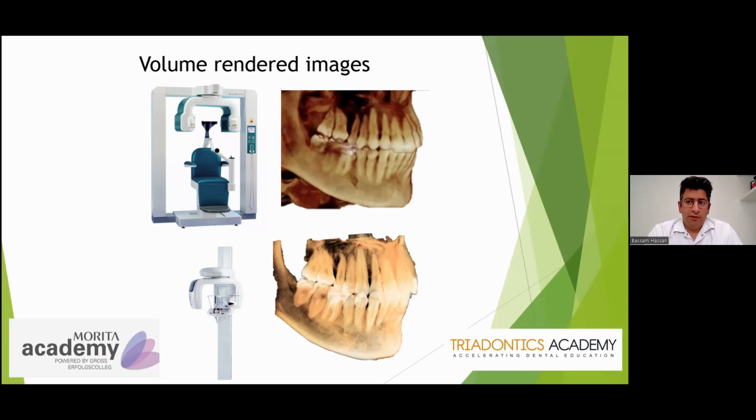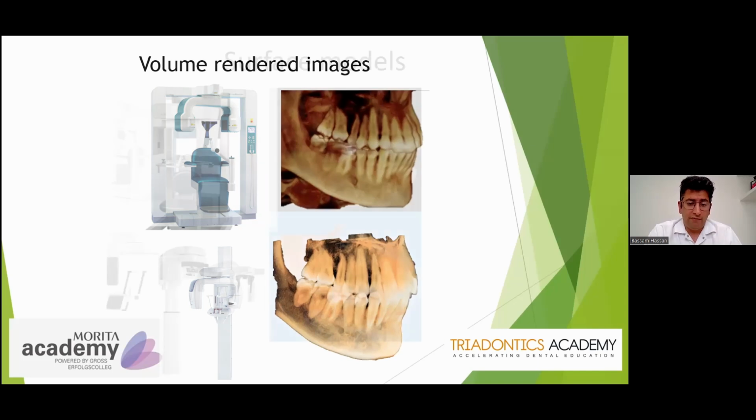You cannot get soft tissue with cone beam. You will never be able to replace CT for an MRI. It's not an ultrasound. It's just how the technology works. But many things have improved. I'm not saying that it did not improve in the past 15 years. Many things improved, but not the image resolution itself.